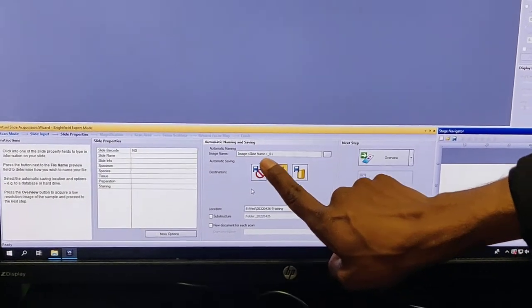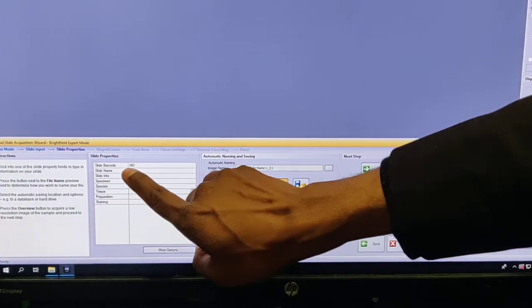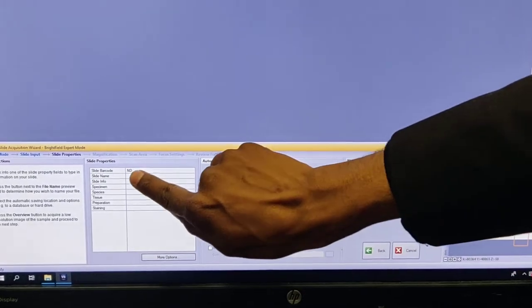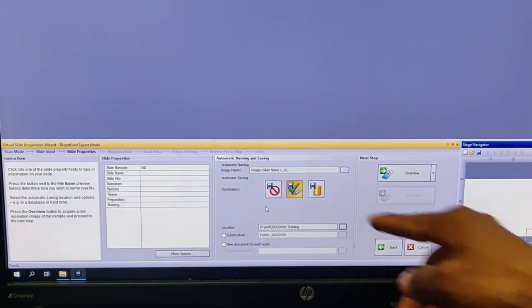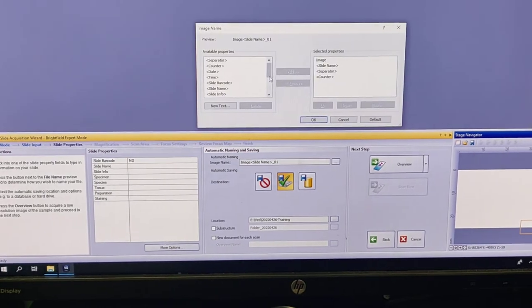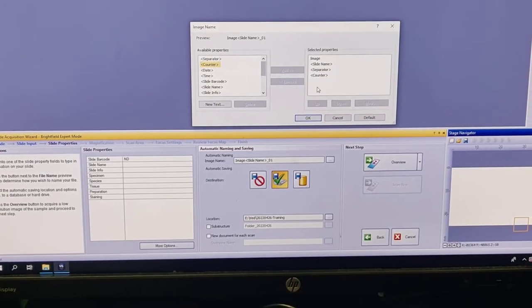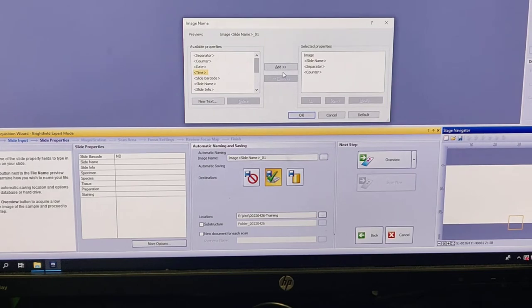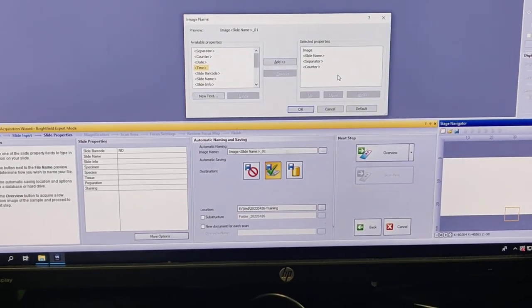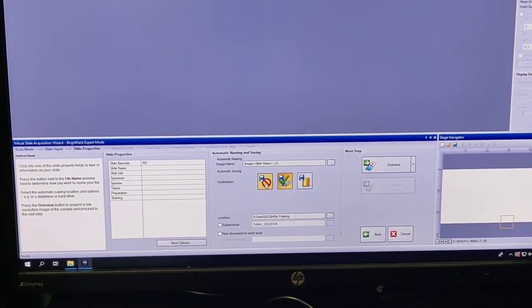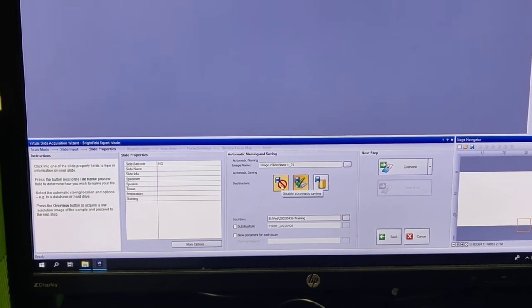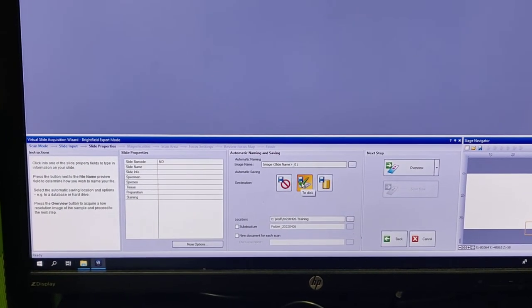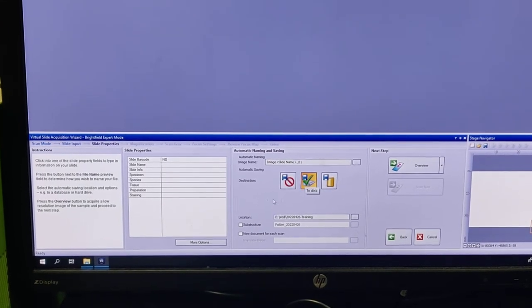With regards to the file name, it basically uses the slide name, whatever you choose, and the numbers and all of that. You can always change what you want by selecting this and then applying. Slide time you add, so now it will keep adding more and more details to the file name. If you click this one, it will not store the file. So make sure that this is on the save to disk mode.